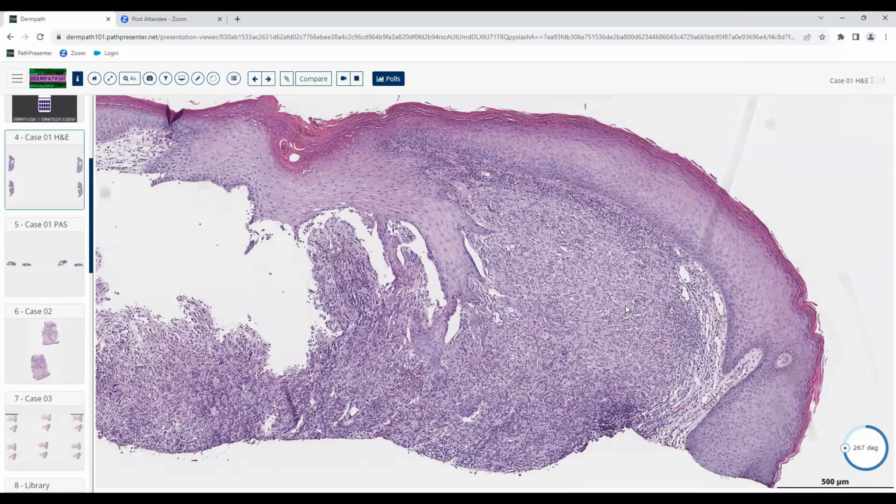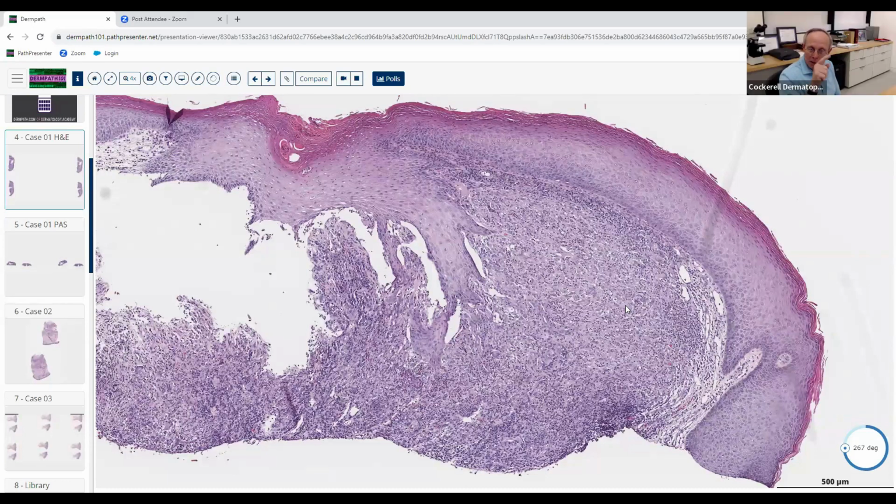Sorry, Marissa, if you don't mind, I can suggest some too. Yeah, go ahead. There's sarcoidal or naked. Sarcoidal, good. That's excellent. So there you see small, round epithelioid granulomas, usually with limited lymphocytes. So that's sarcoidal granulomatous. There's also suppurative granulomatous.